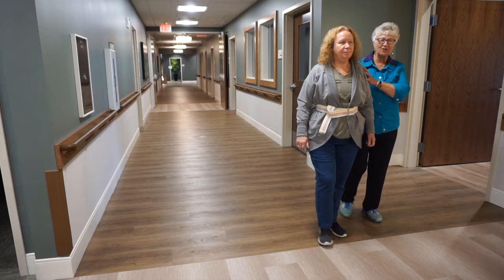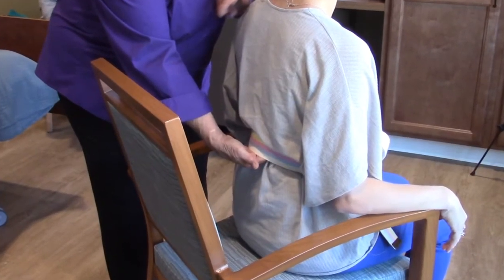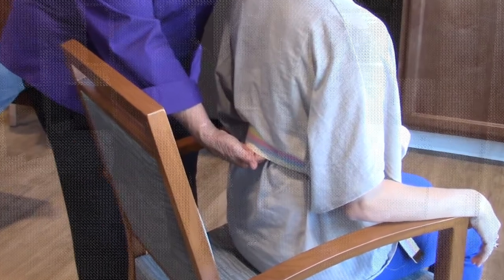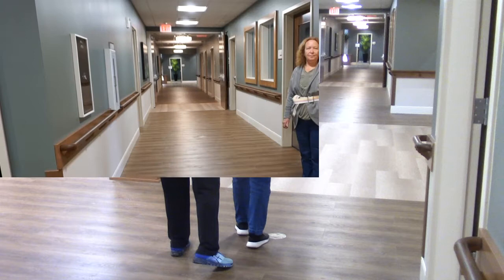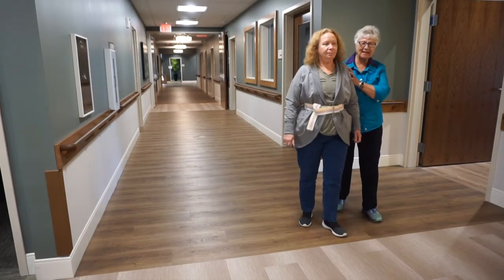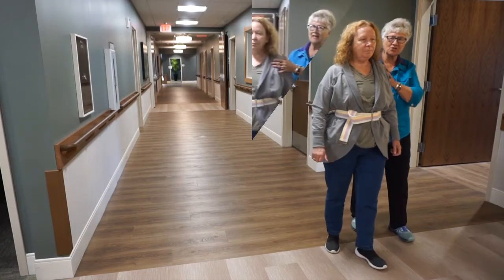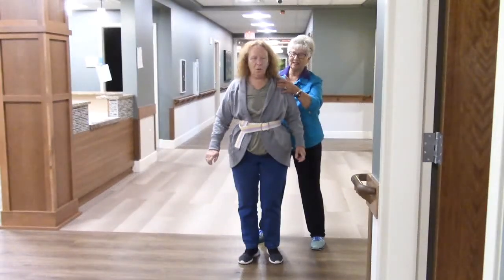To use a gait belt to assist with walking, grasp the gait belt with one hand, palm up, and walk behind and slightly to one side of the person. Place your free hand on the person's shoulder to steady him or her. If the person stumbles, widen your base of support, pull back on the gait belt, and steady the person using your hand that is on the person's shoulder.